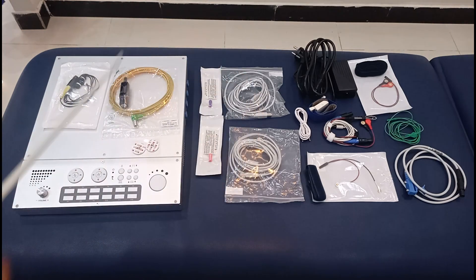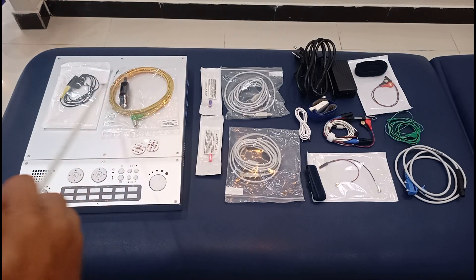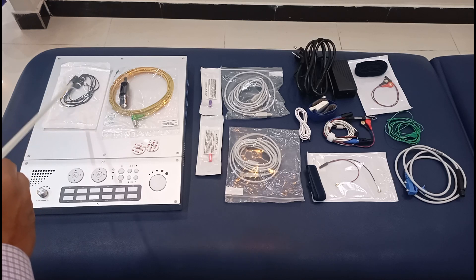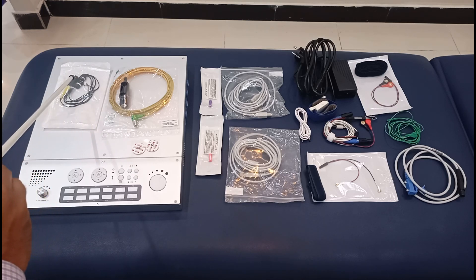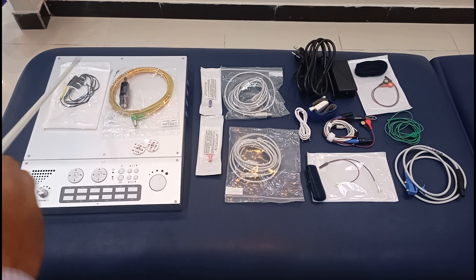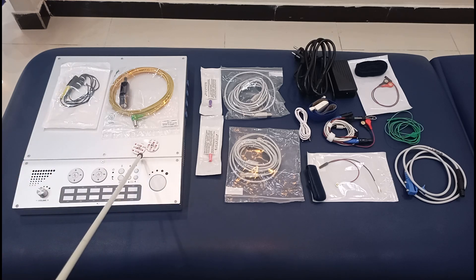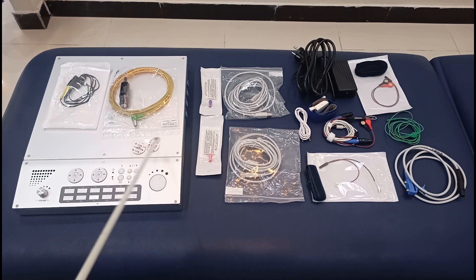These are the earphones and they are used while someone is performing electromyography. There are various conditions that have characteristic sounds, so you need these earphones connected so you can listen to those sounds.